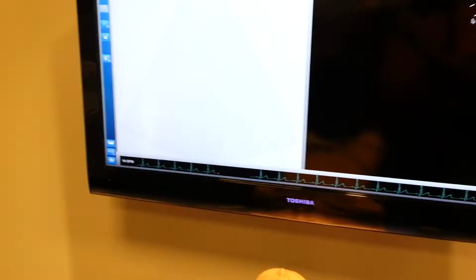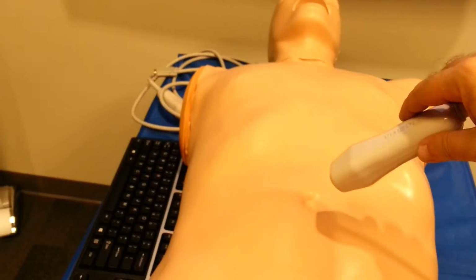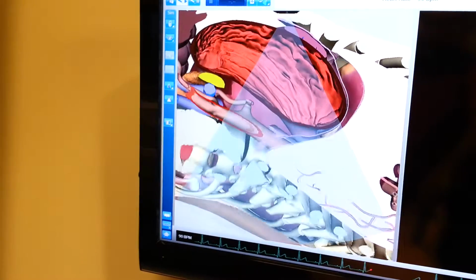Condition, go. The patient's reactions will automatically adjust in real time based on what the students are doing. So you don't have to be sitting there saying, oh, I missed it, I didn't see Sandra do that. It will automatically all adjust itself. You can give it drugs, it will react accordingly.